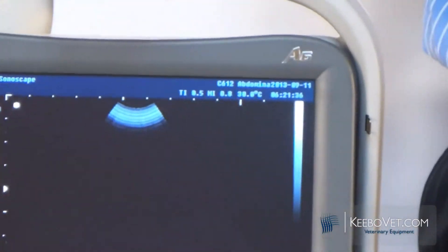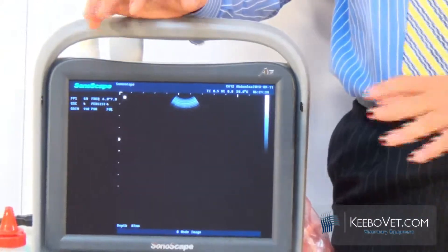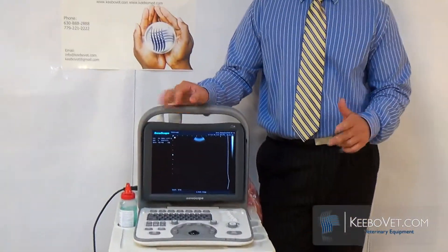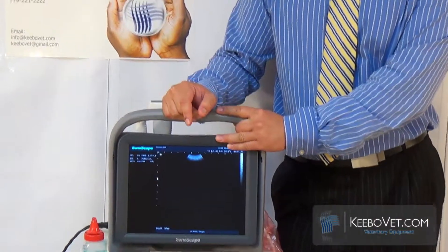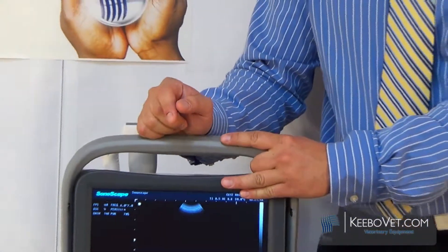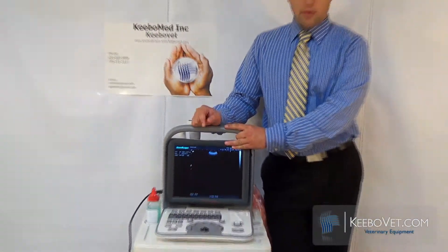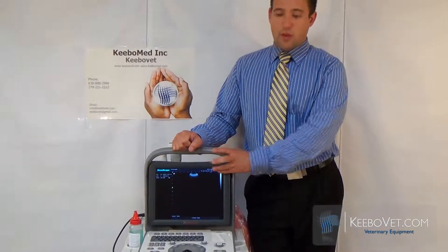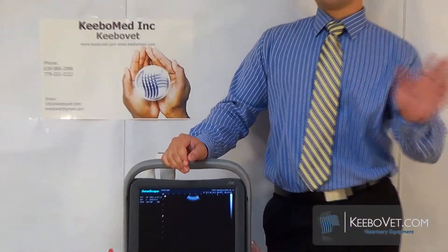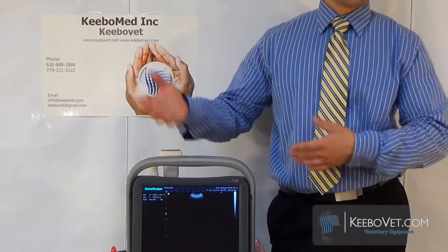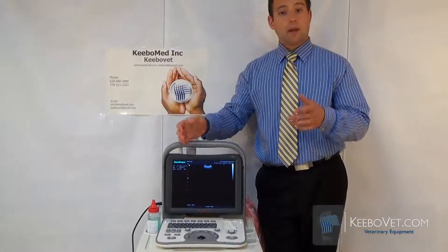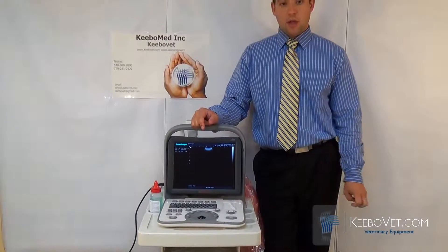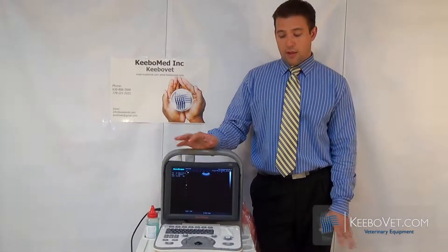Another feature is M-tuning, which is related to image quality. You hit the button and if you don't know how to change settings like gain, depth, or field of view, the computer does it for you. We also have a clipboard — when you take and save images, you can scroll through a list, just like a clipboard on your computer. You can delete, save, include, or forward images — basically all the great functions you need.